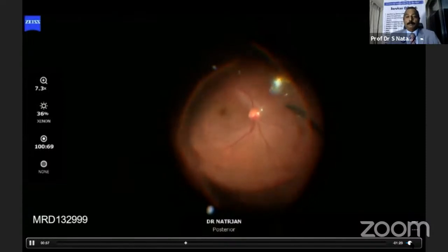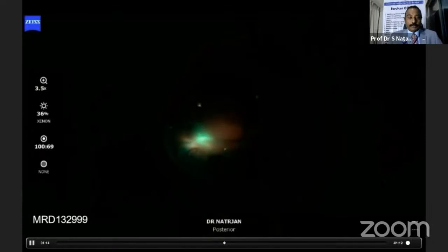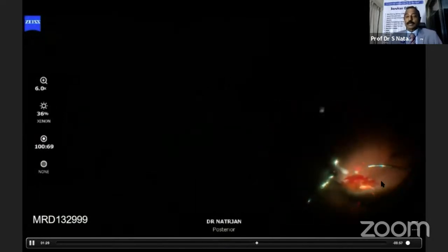And here you see a total retinal attachment. Now, perfluorocarbon liquid is being injected, and you can make sure that you see from the disc to the periphery, and all this is possible because whatever you see, your assistant, the nurse, and the boys can see. And I think if you read Stalad's first chapter, point number two, he says, you can see this is a giant retinal tear, and the perfluorocarbon liquid is filled up to the extreme periphery, and then you are doing the endolaser photocoagulation around the giant retinal tear, and you see the retina totally attached, and there's a curved laser probe, with which we do the endolaser around the break.